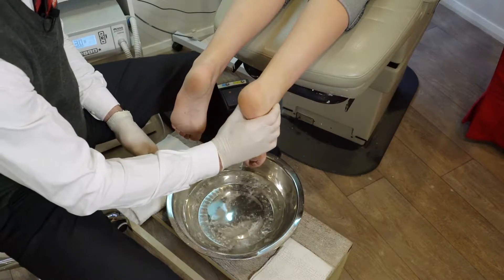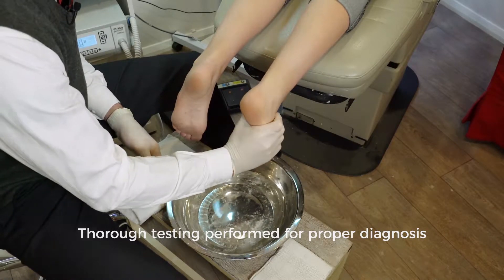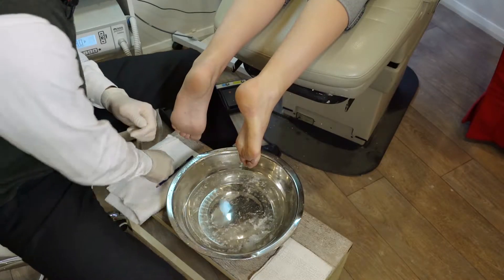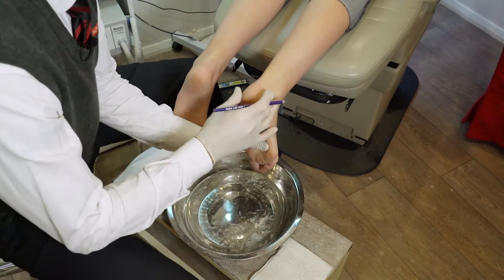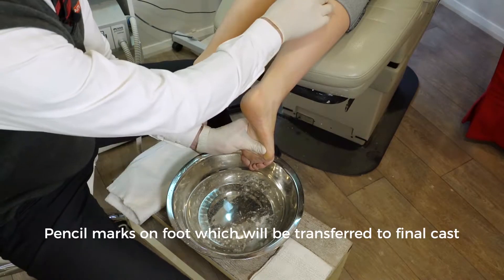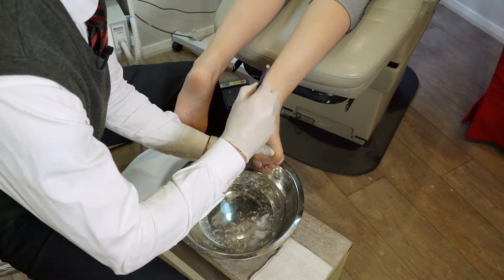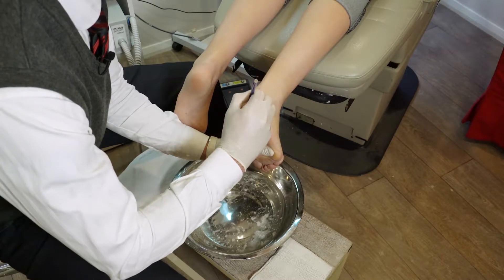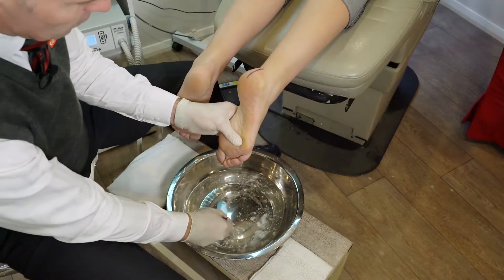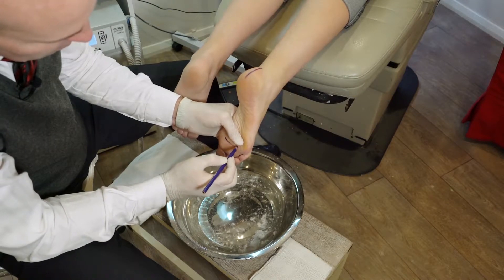We've tested the range of motion, the flexibility of the foot, and all other diagnostic tests. Now we're casting up the feet. We start off by putting on some indelible pencil marks — the line down the back here is the midline of the calcaneus, which should reflect basically the midline of the lower leg, meaning the rear foot is in a neutral position. These marks get reflected inside the negative cast and then from inside the negative cast to the outside of the positive cast.